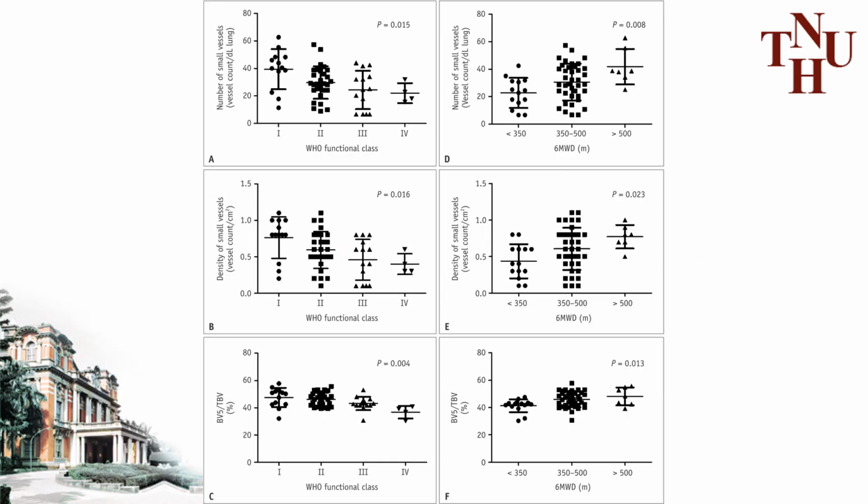These are the comparisons between the radiographic pulmonary vasculatures and the clinical parameters. The WHO functional classes are inversely associated with radiographic pulmonary vasculatures, whereas 6-minute walking distance is positively associated with radiographic pulmonary vasculatures.